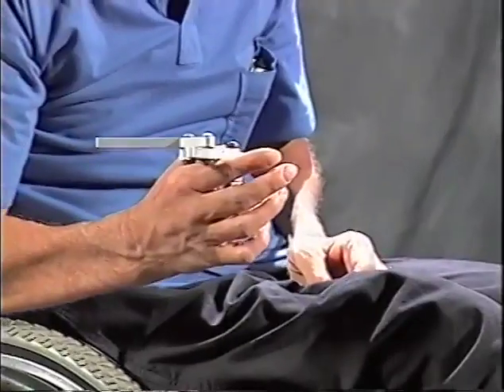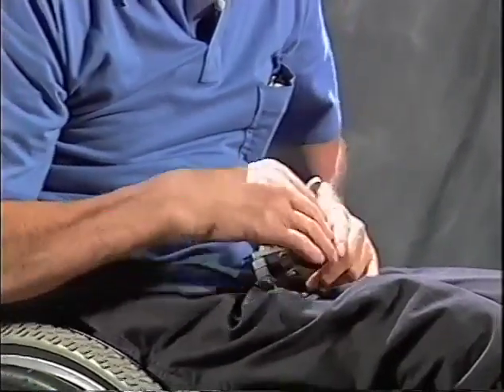The scissor brakes are very good for sports, but they're particularly awkward to use in everyday application. The push brakes are handy for a lot of quadriplegics who have any little bit of triceps or even shoulder muscles that can push forward and put a lever on it. And the pull brakes actually work good for some quadriplegics who have no triceps and want to be able to pull their brakes on. So you have limited choices as to which brakes are out there. And once you find out which setup works for you, you can certainly order that type of brake easy enough when you get your wheelchair.